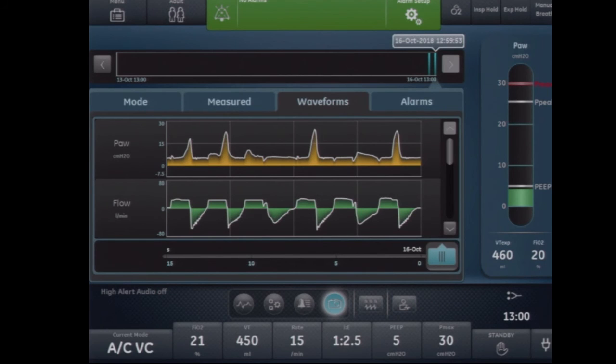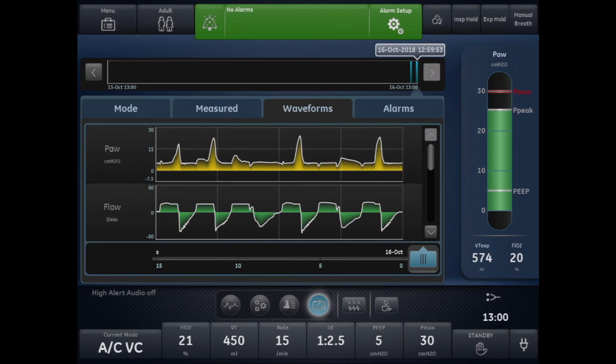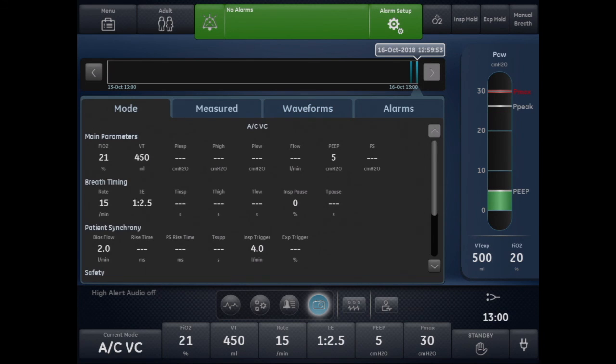When we're reviewing the snapshot, you can see from the yellow pressure waveform I have this pressure scooping. So this indicates a flow mismatch, that the flow is not set appropriate for the patient's need. So what I can also do is look at my flow settings, reevaluate, and titrate my flow based on my patient's inspiratory drive. Now I'm just going to use the trends list cursor and move along the pressure waveform and evaluate the different pressures during my inspiratory phases. And you can see the patient's sucking back quite a bit. So we'll have peak pressures in the 22, but they'll suck back so much.